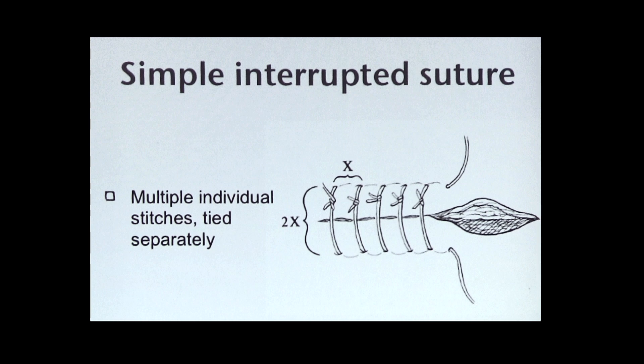To determine how many stitches you'll need, use this as a guide. The first stitch should bisect the wound. Then the next stitches should bisect those two halves and so on. You'll want to use the least amount of stitches possible, as each stitch is a new trauma to the skin and you want to minimize that. This will also ensure an even distribution of stitches, which is ideal.